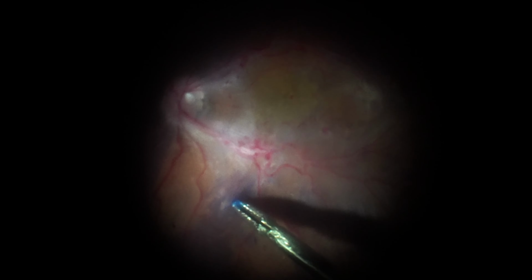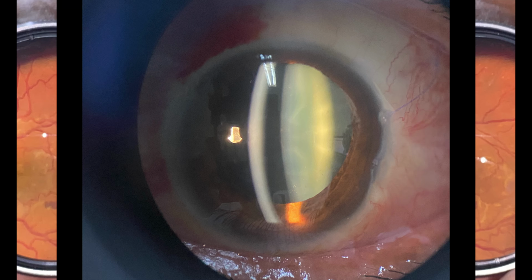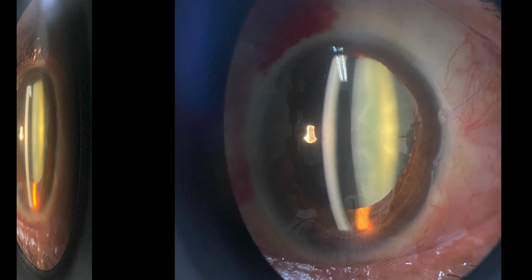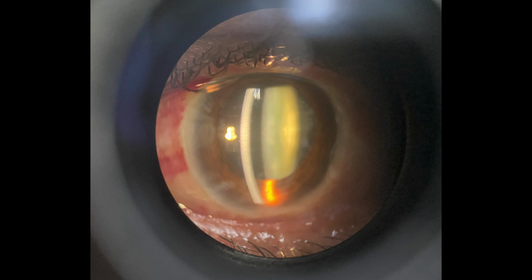Endolaser is another step so that the peripheral retina will be protected, mainly at the sclerotomy sites. The lens remains clear at all times, and you may observe here the good red reflex and clear lens towards the postoperative period, as well as the good retina looking and now without the macular pucker.